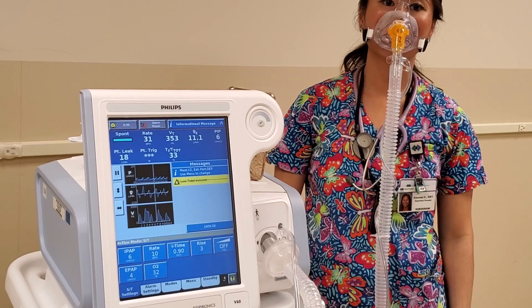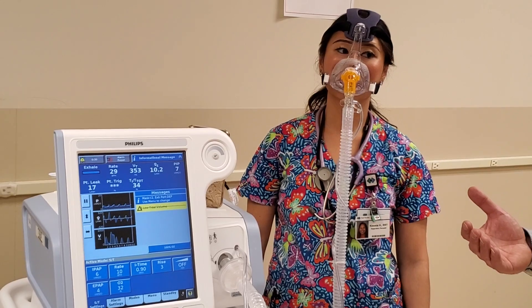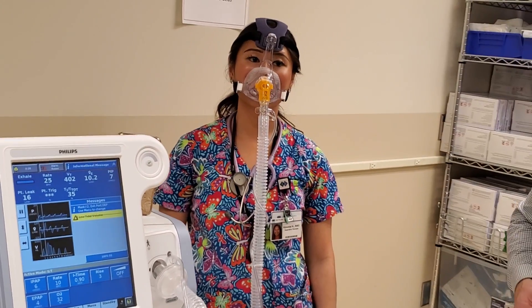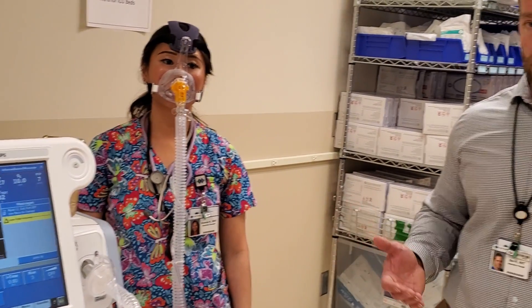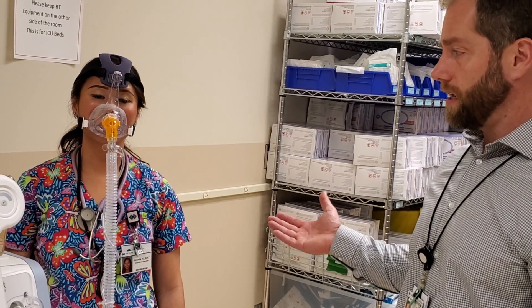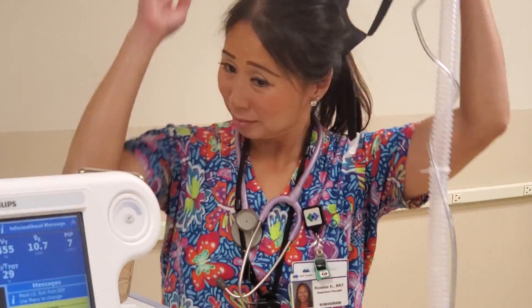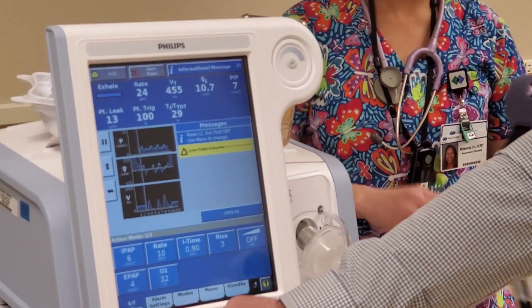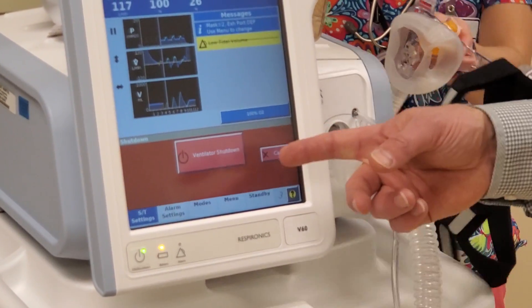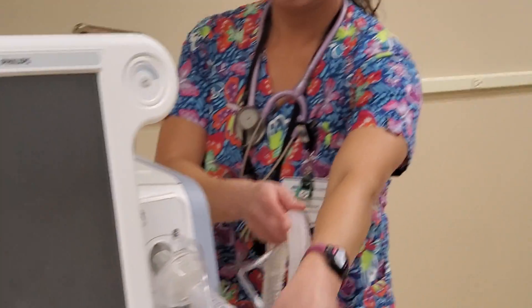To wrap this video up: if you have a patient on a BiPAP, you'll eventually need to take them off for the day or for a longer period of time. When it's time, take the mask off, press the power button, and then when it says 'ventilator shut down' press that — and we're good to go. Hopefully that gets you through the use of your BiPAP.